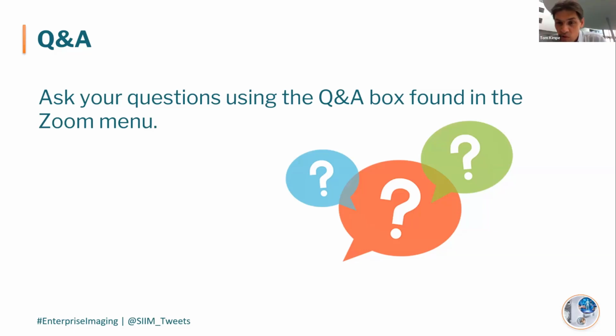Yes, of course, Andrew. There were very interesting questions. For example, on the pyramid structure of the pathology images, whether all those different resolution levels are present at the same time in the file. The answer is yes. Mostly the scanner formats include all those different levels in one and the same file, so that you can quickly zoom. There was an interesting question on off-axis viewing: if you have multiple displays next to each other and you look at them at an angle, whether that's a problem. The answer there was no. With high-end modern medical display systems, we pick very high-quality panels that allow for slight off-axis viewing, and in typical viewing conditions, this will absolutely not be a problem.